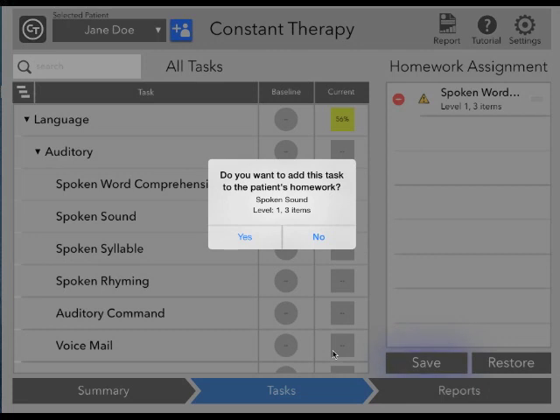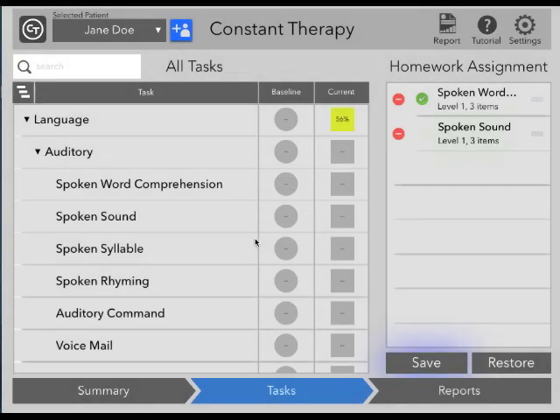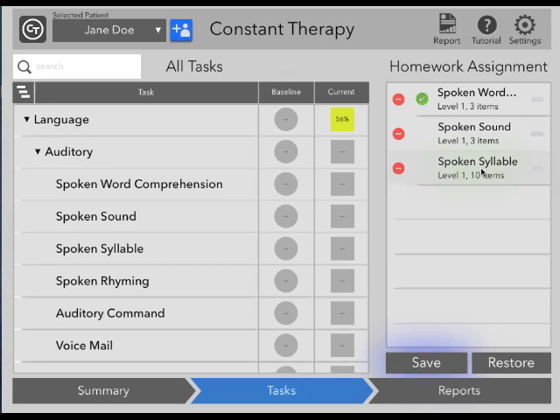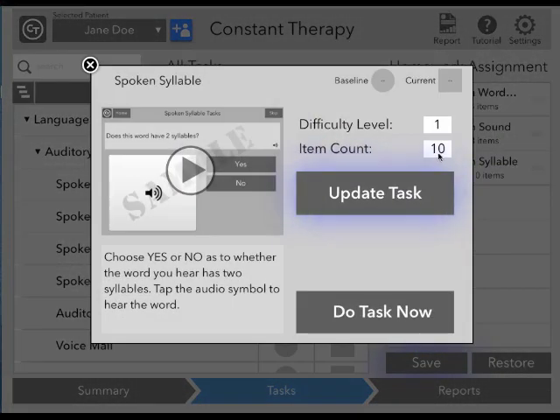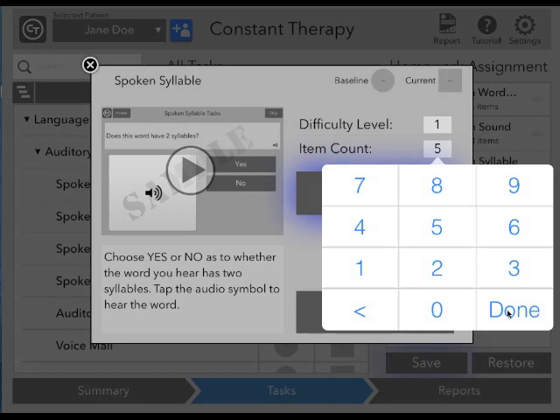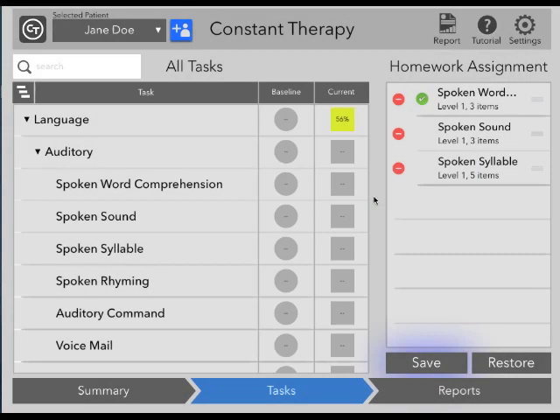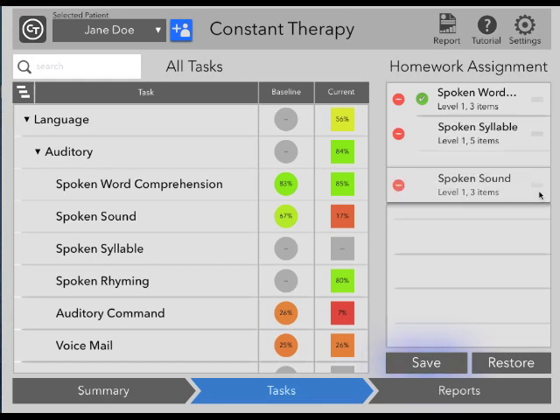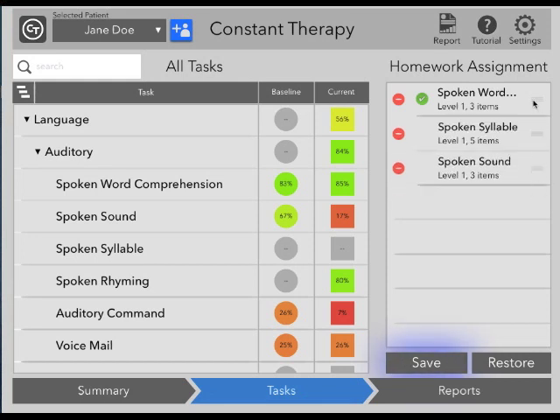We now see a pop-up asking if we would like to add this task to the patient's homework. If we tap Yes, the homework will be moved and we'll see that task go to the right side of the screen under Homework Assignment. We can also add tasks to the homework assignment by tapping and dragging from the left. If you need to adjust the item count or difficulty, simply tap on the task and then tap Update Task. In the homework assignment list, you can also change the order of items by tapping and dragging on the three lines, allowing you to change the order to whatever best suits your patient.